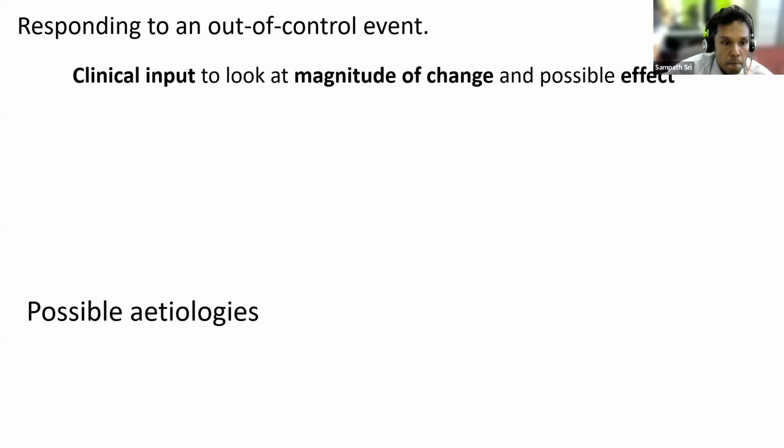When we are finding out possible etiologies, we have to look for clinical input. When we are responding to an out-of-control event, we have to give clinical input.